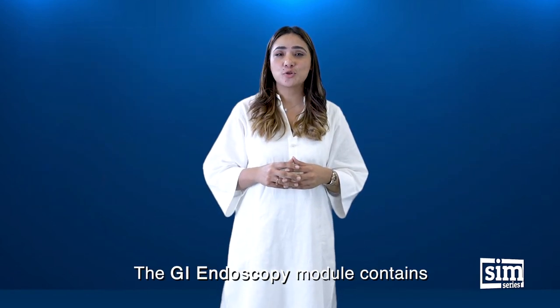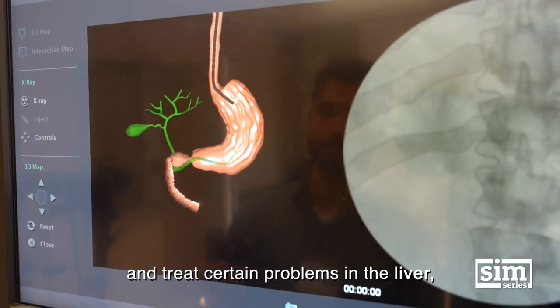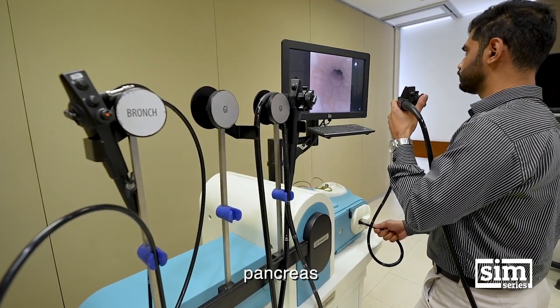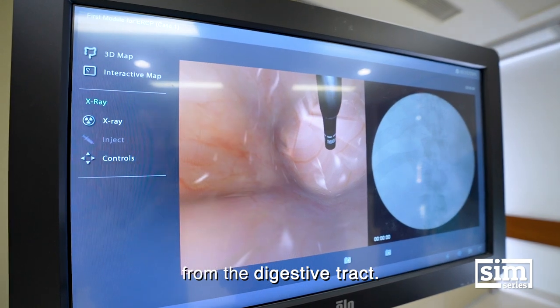The GI Endoscopy module contains ERCP, EMR and ESD that helps to diagnose and treat certain problems in the liver, gallbladder, pancreas and is used to remove precancerous, early-stage cancer or other abnormal tissues from the digestive tract.